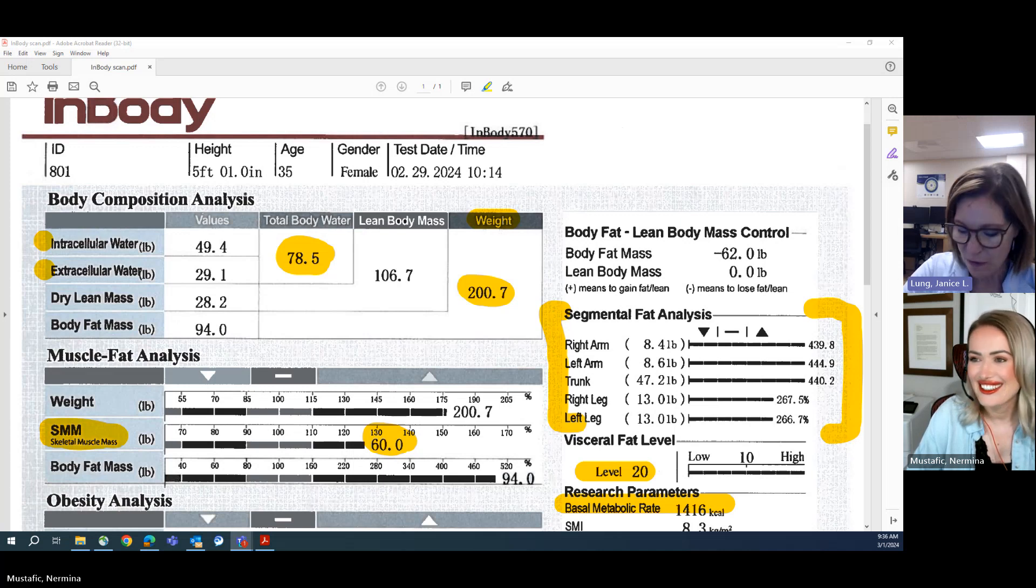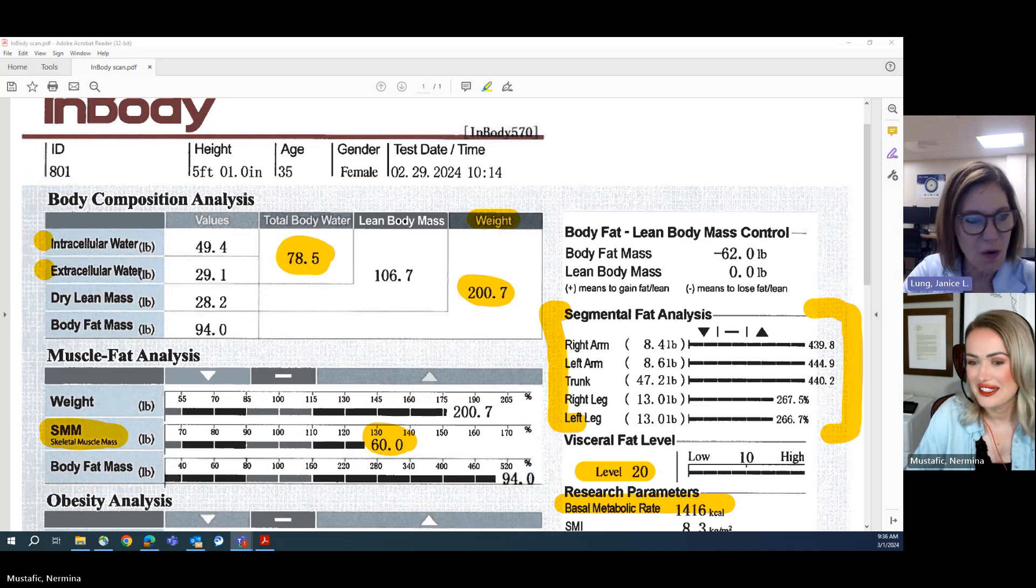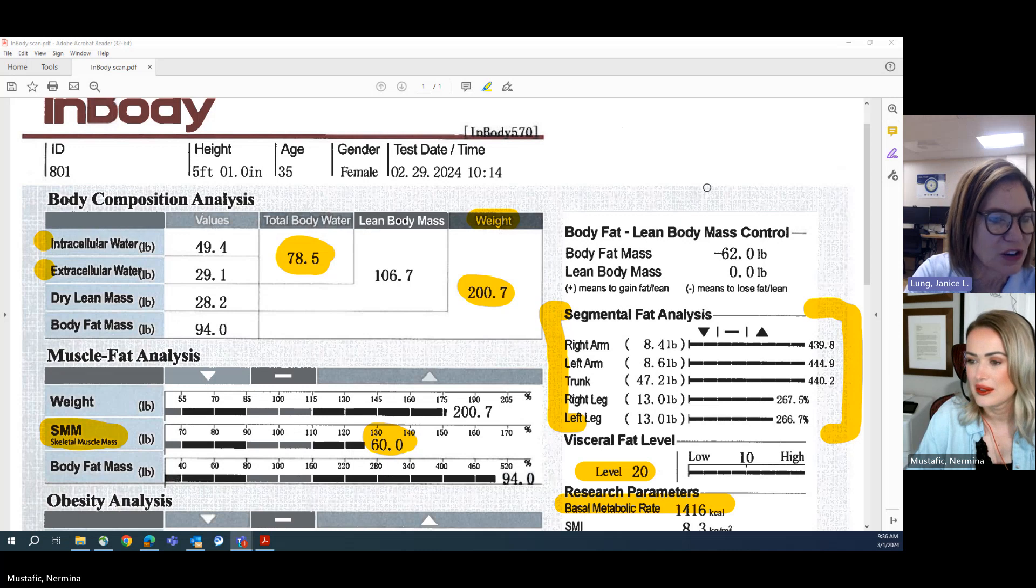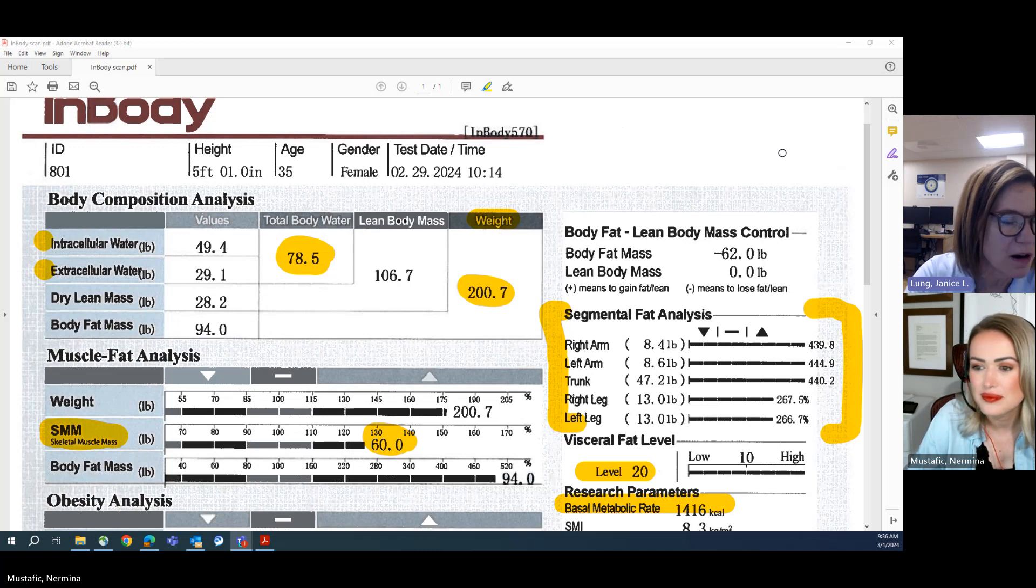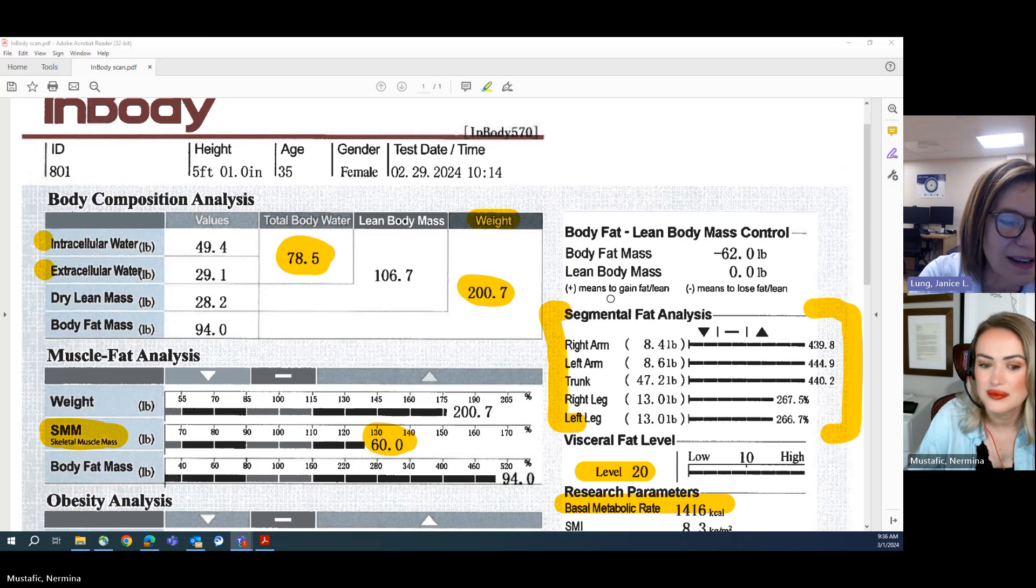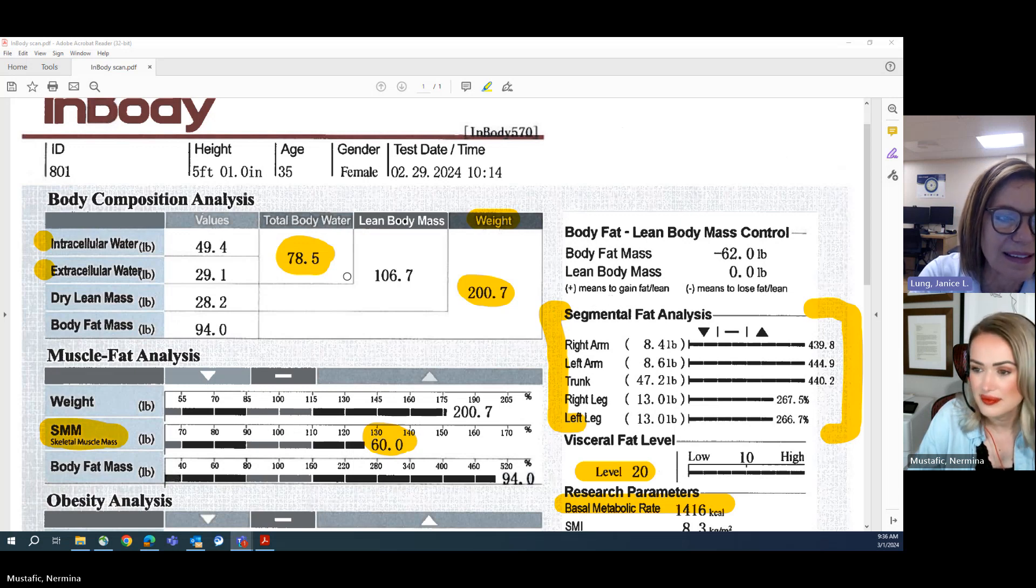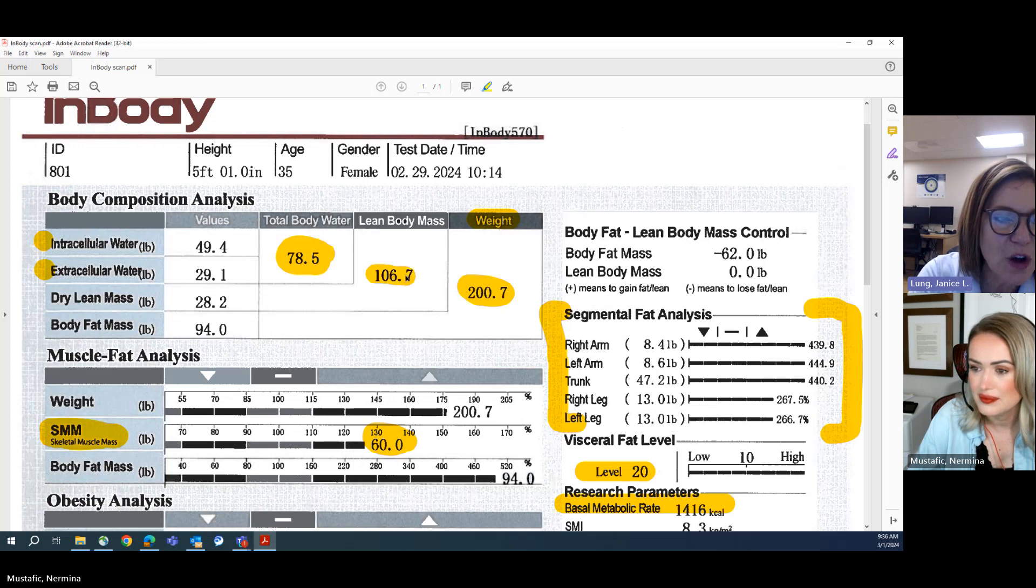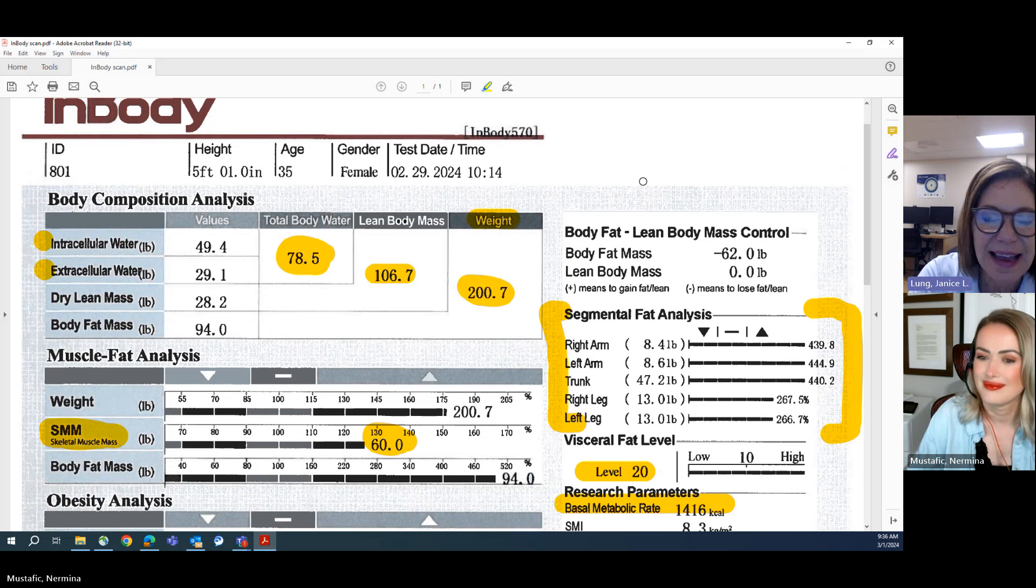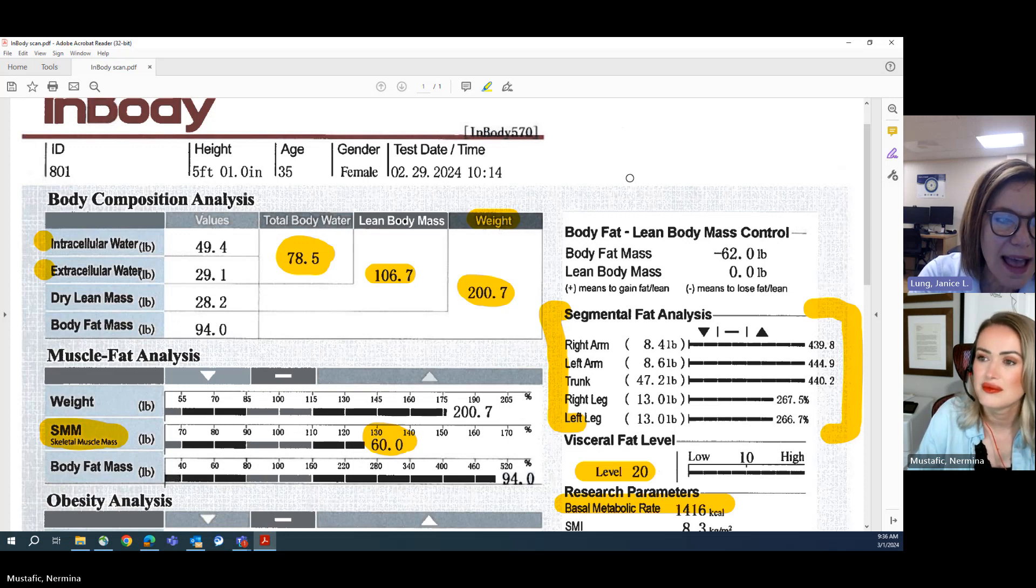If we continue looking at that body composition analysis, the first part of the sheet there, we can see that of their 200 pounds, 106.7 is lean body mass. So more than half of their weight is lean mass, and that's important to know.